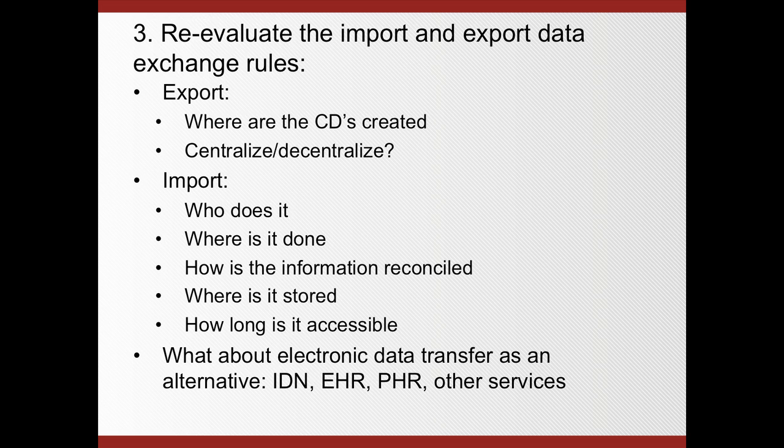So what about the electronic data transfer? It will not be too long before patients, instead of having a CD, will just give you the authentication and authorization to access the personal health record, where you as a user can have access to all the information of that patient, including the images. So it probably will happen first when you have an integrated delivery network, an IDN, because in that case you don't necessarily have any competition rules, and you might be willing to freely share that information.